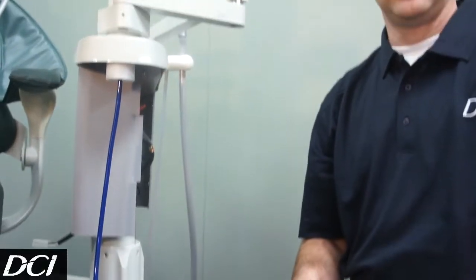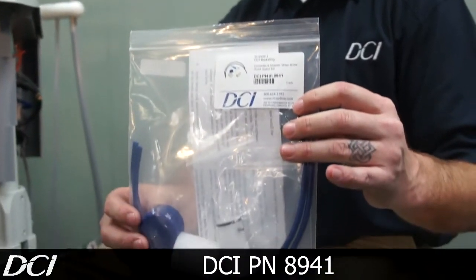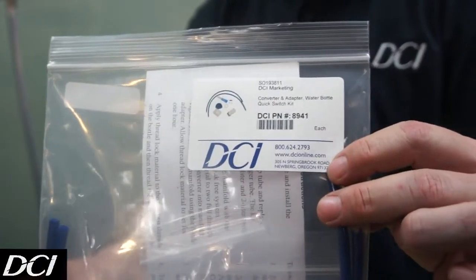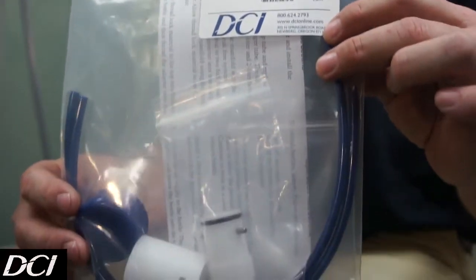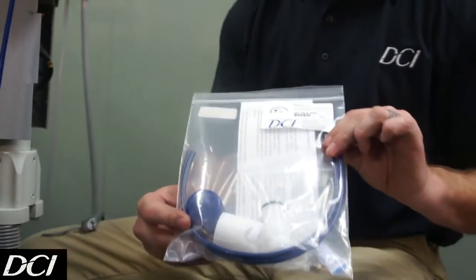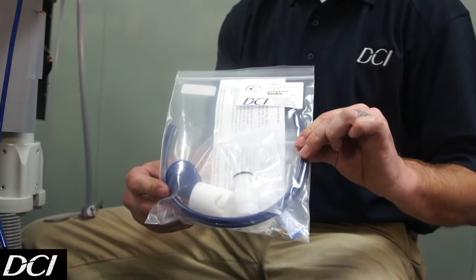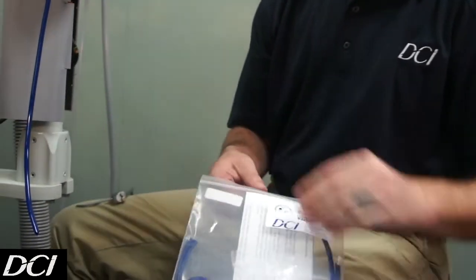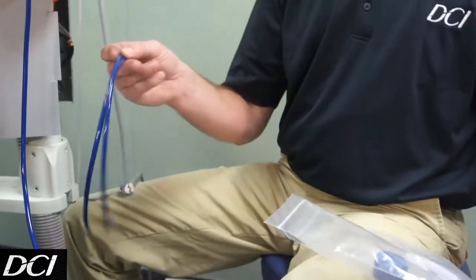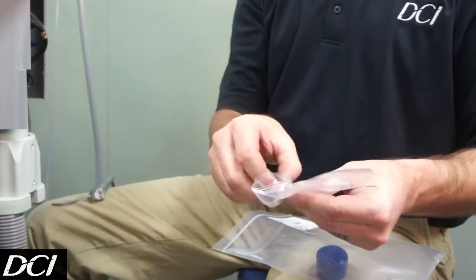We're going to take our kit. This kit is part number 8941 — it's a quick switch water bottle kit. It's going to have the proper manifold to go on the bottle and also up into the unit, along with some extended tubings to reach down far enough for that new bottle adapter. Inside you're going to have your instructions, adapter, new tubings, bottle adapter, and a little bit of thread locker.